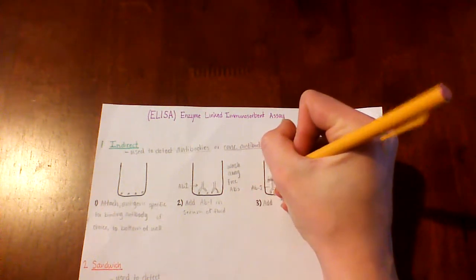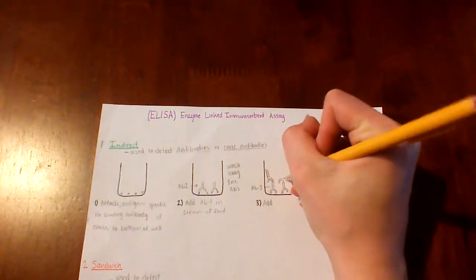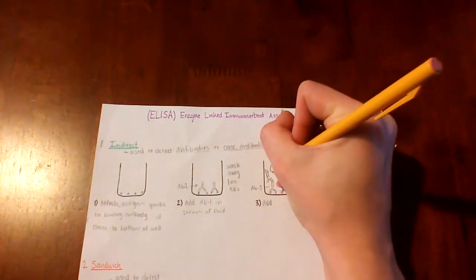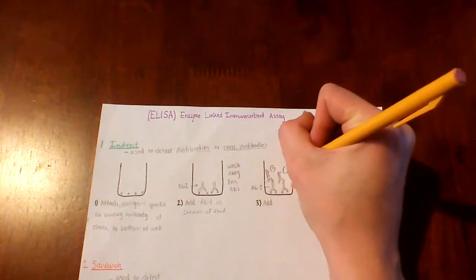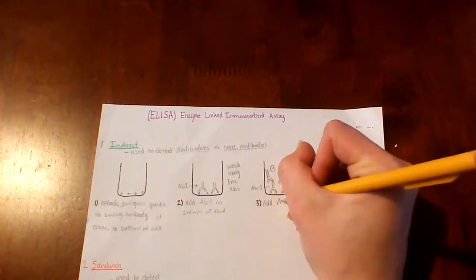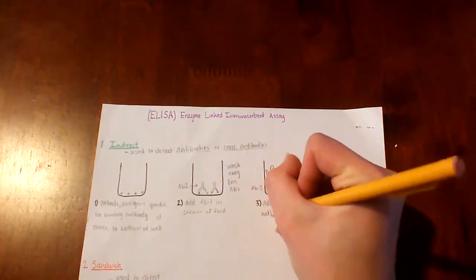So the secondary antibody here binds to primary. It has an enzyme attached. So I'm going to draw these enzymes. I'm going to draw Pac-Man enzymes. So add antibody 2 with enzyme.